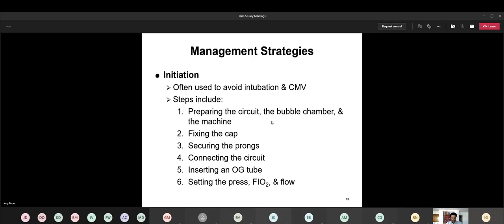And then, of course, whatever your orders are, you enter those into the machine, and then you make adjustments as you need to, and you monitor. So it's essentially another vent check, just like you would for a regular ventilator. It's just that you're going to be documenting different things and not as many things.